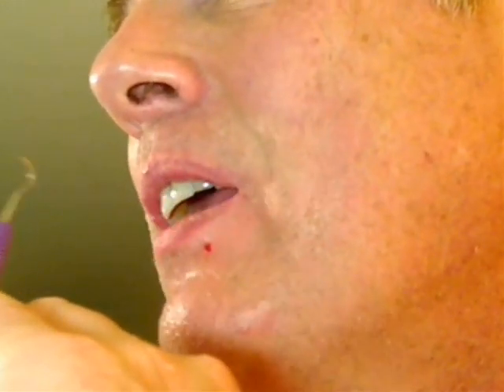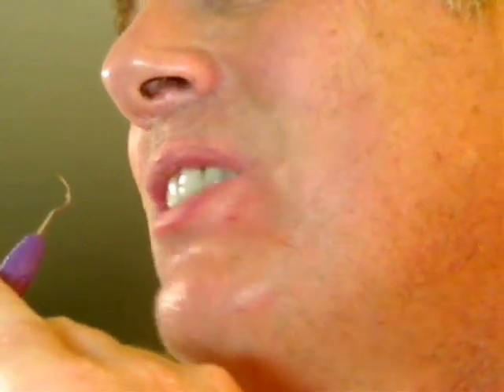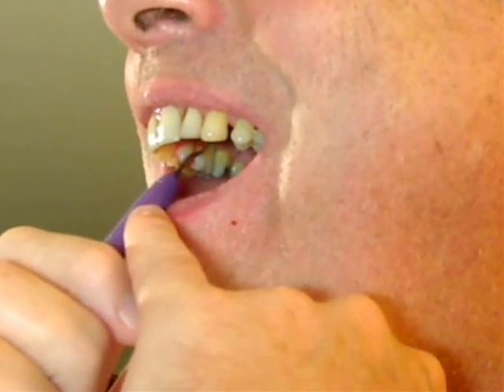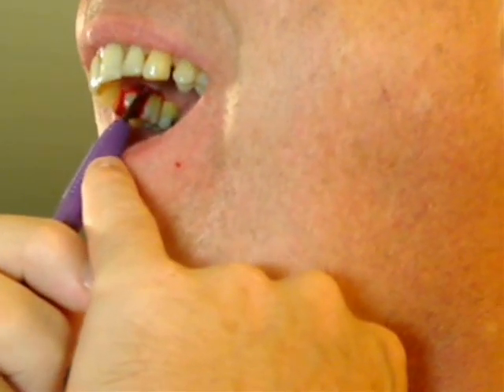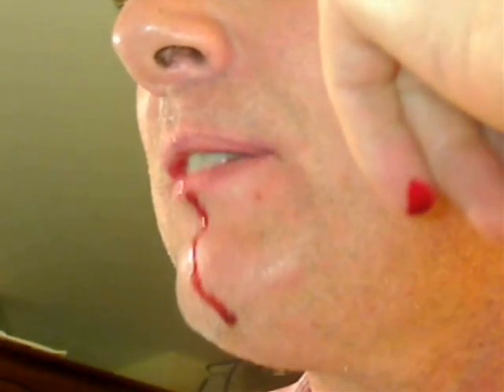I'm being very careful, and I'm trying to remove all the little pieces that are there as gently as I can, and then using the sickle. That tooth is in deep trouble. It just goes deeper and deeper with more and more stuff, but I'm getting a lot of stuff out, so who knows.